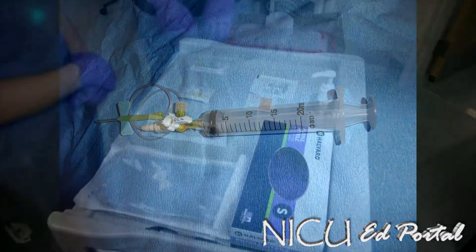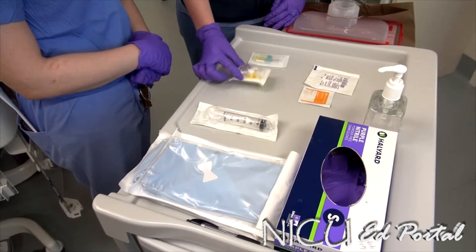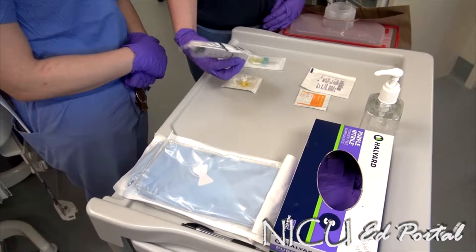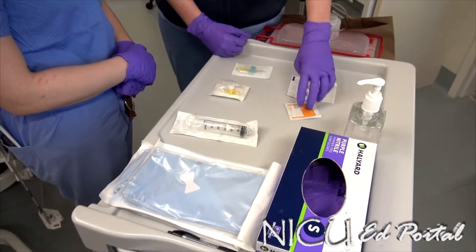Supplies you need for a needle decompression are a 24-gauge butterfly needle, a three-way stopcock, and a large caliber syringe to pull the air off with. To prep the area, you want an alcohol swab and a piece of gauze.